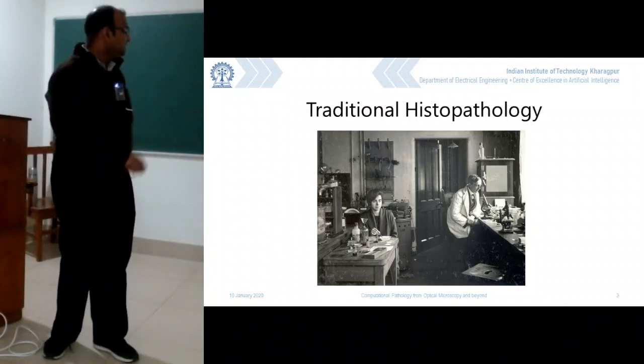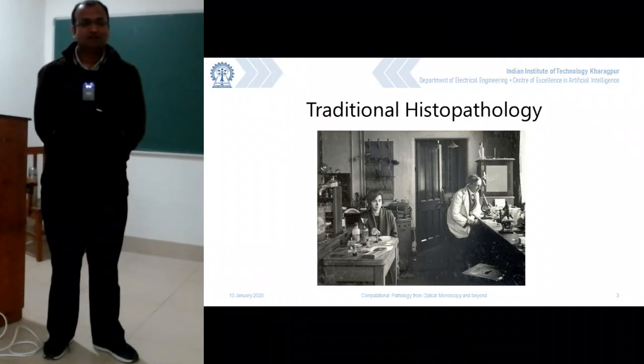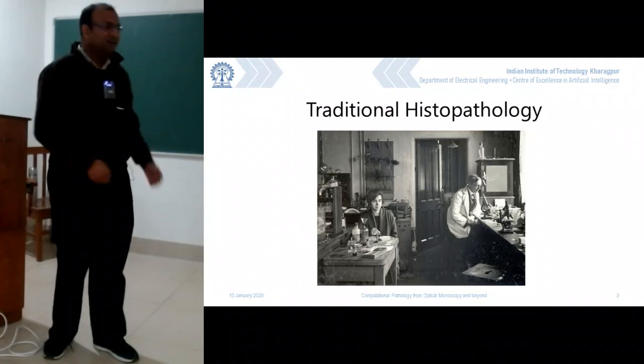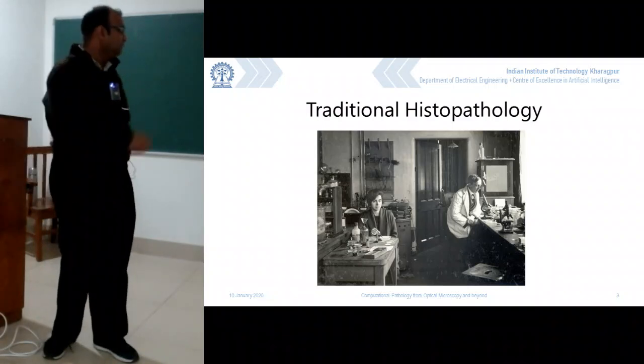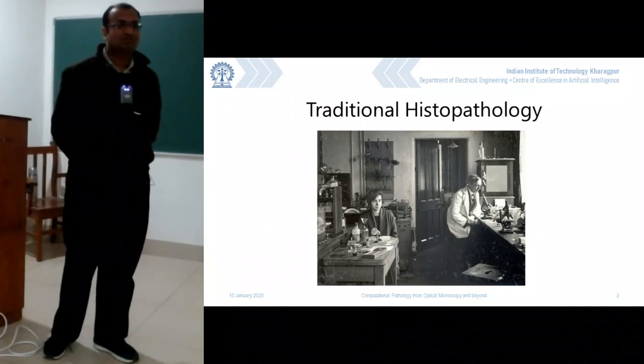Okay. So typically what happens is you have one person who is generally called a medical lab technologist, MLT. That's a BSc program in most parts of the world. A medical lab technologist is the one who prepares the slides. And then there is the histopathologist, and typically these people have an MD degree in pathology. They are trained medical doctors who are supposed to give the final diagnostic outcome. So the slide preparation is up to here. The slide readout and the report signing off is what this person does.